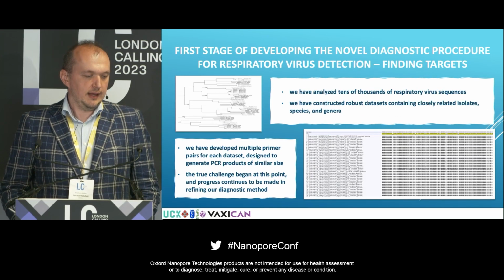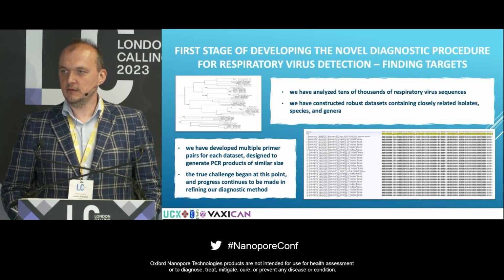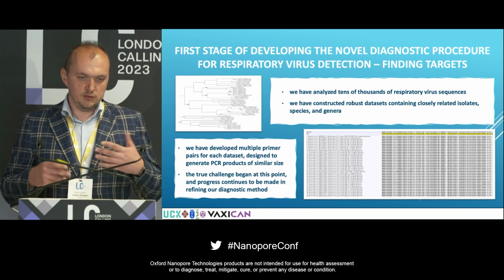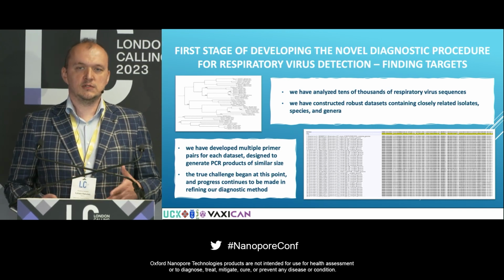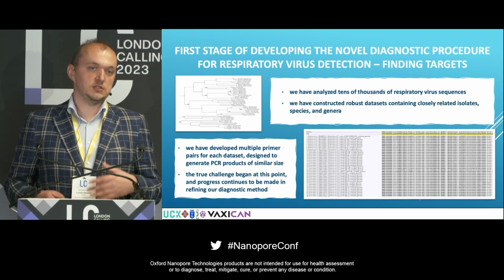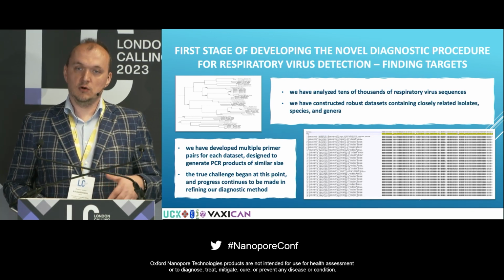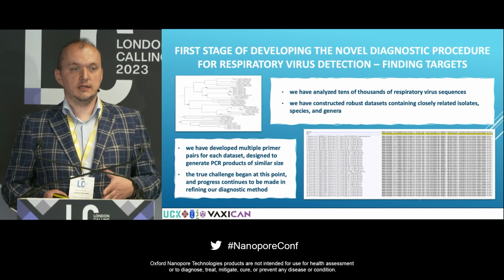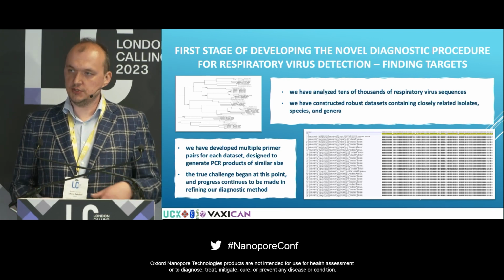We target almost all the main families of viruses that infect the human upper respiratory tract. In the beginning, we analyzed thousands of sequences, and then we used phylogenetic analysis to group those sequences, because for rhinoviruses, for example, there are so many of them and they are so different that it wasn't easy to design one pair of primers. So there were multiple pairs of primers only for rhinoviruses. And we didn't want to use published data, so we made everything from scratch.